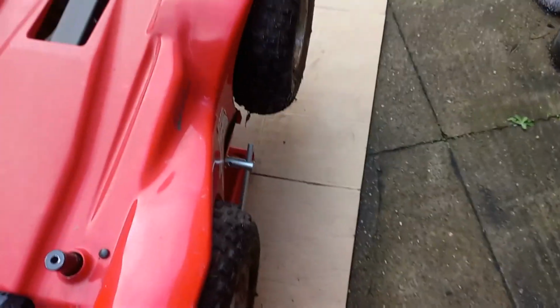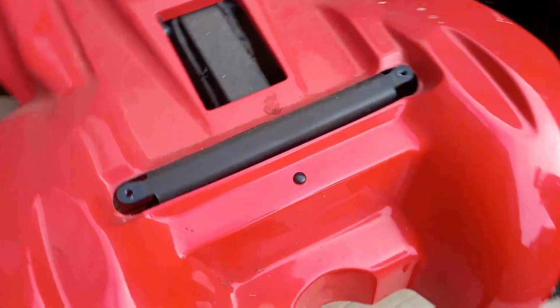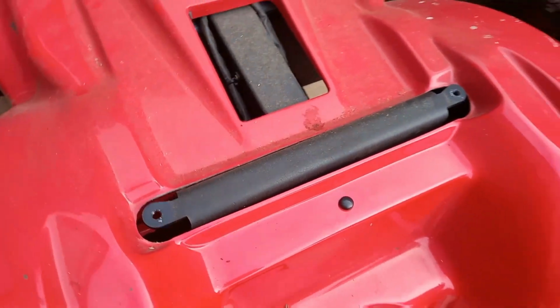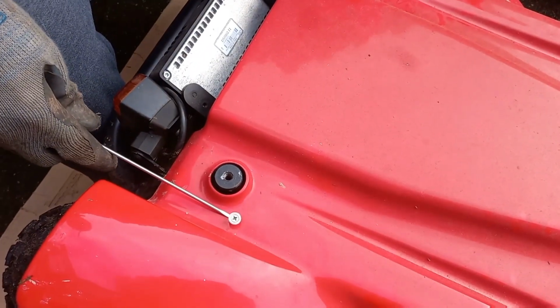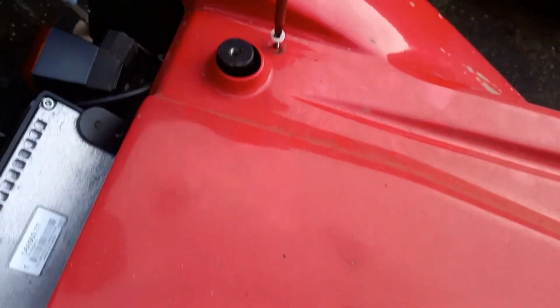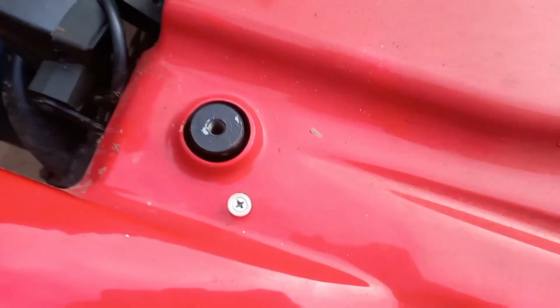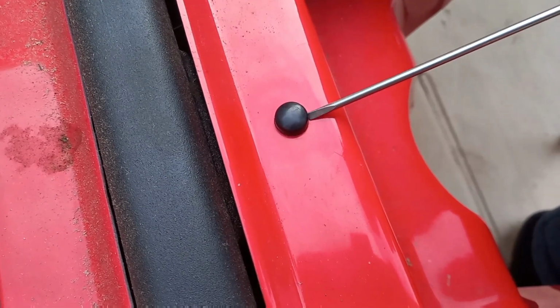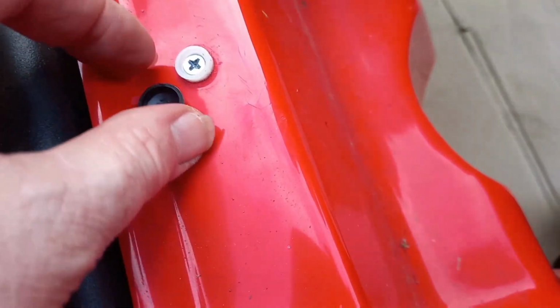They're loose. Taking the plastics off now, and there's 3 fasteners and they're underneath. You just pop them off with a little screwdriver like that, and you just get it at the side and then just flick them. I'll show you in a minute on the front one. This is quite stiff, this one, eh? And then the screws are underneath. Why is this so stiff? That went with a pop.